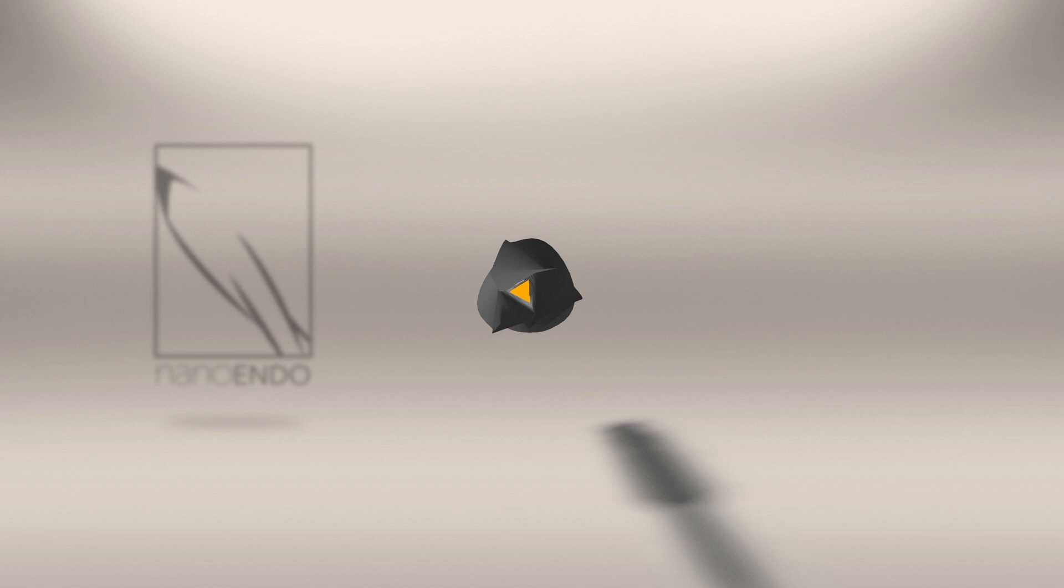The tip's cross-sectional symmetry means its center of rotation and center of mass are one and the same. This enhances both the exoendo's strength and its ability to follow a canal's central axis.